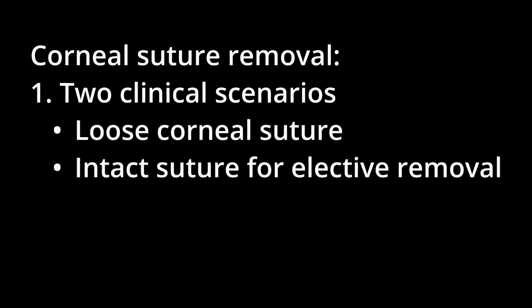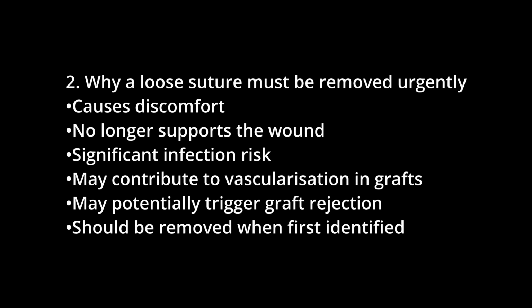In this video, we will cover two related but distinct situations. The first is removal of a loose corneal suture. The second is removal of a corneal suture that is not loose, but has reached the point where we'd normally remove it electively. A loose suture should be removed urgently.